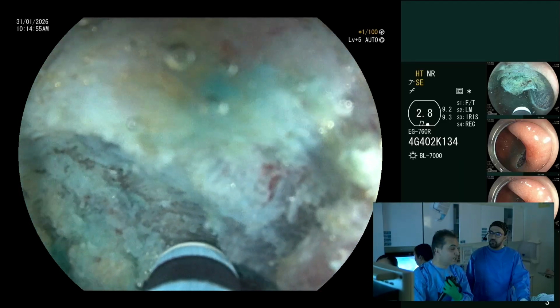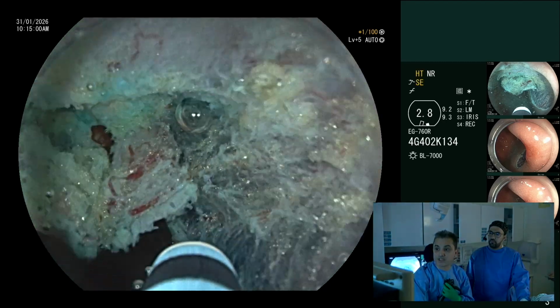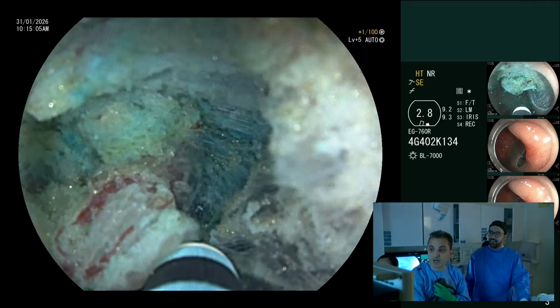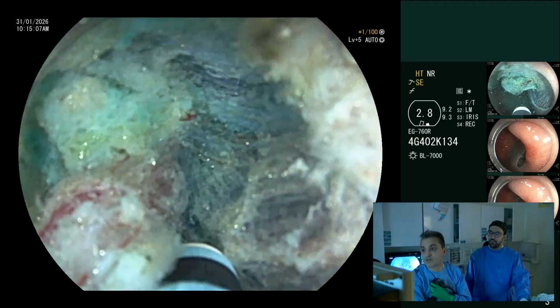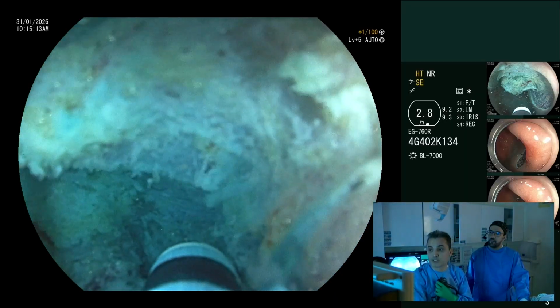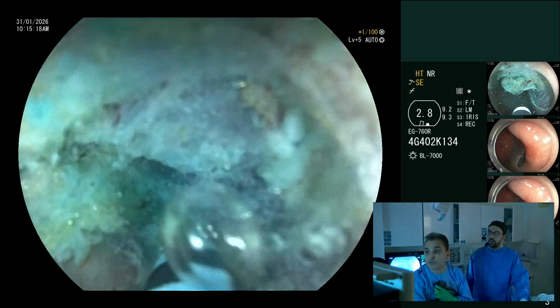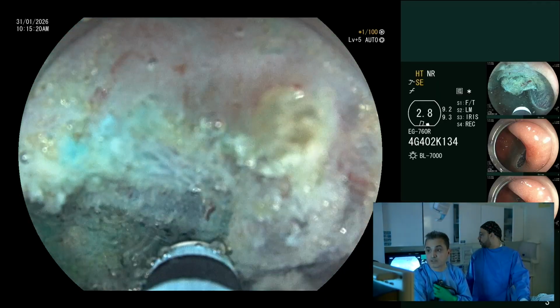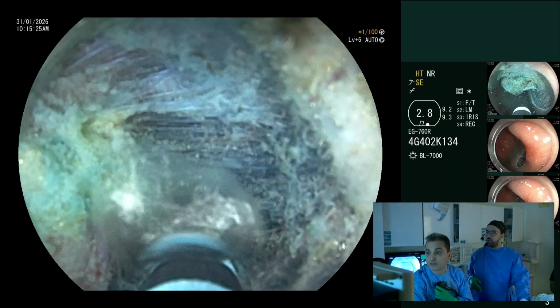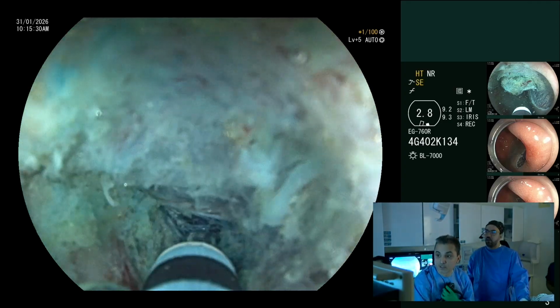So we were obliged to change the position, and of course most of the procedure was done by my brother Dr. Nawaf. I am just taking part of the procedure. He did very well with the incision of the proximal margin, because our strategy from the start was to get rid of the most difficult part. Injection. So we try to go underwater. It's around 2 centimeters in the sigmoid angle. So we made the proximal incision because it was the difficult part initially. Then now we are navigating the dissection as a regular one.